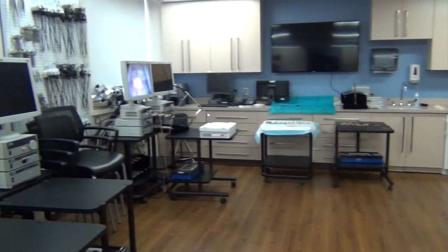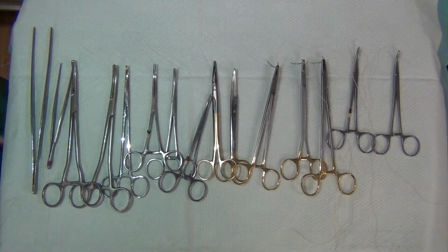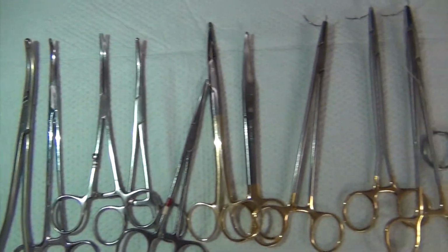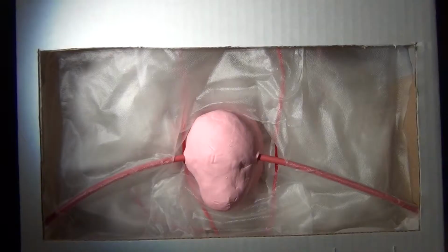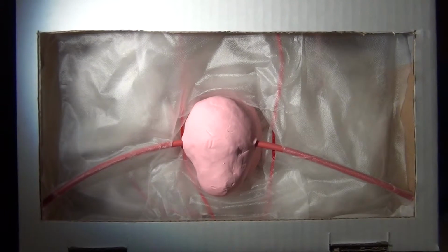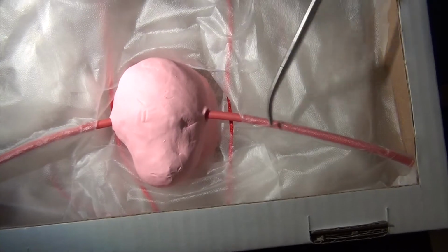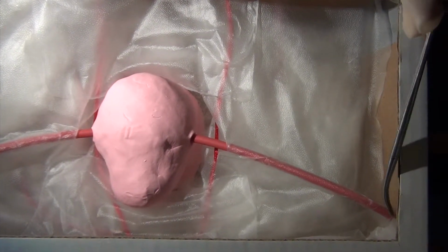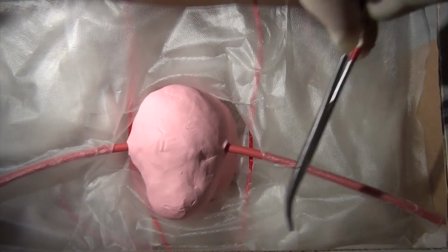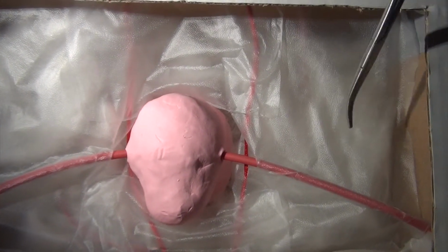So this is our simulation lab at Georgetown University Hospital. And next you'll see the instruments that are being used for the simulation. And note on our model there is no adnexa, but we will pretend for the sake of the simulation that an adnexa exists. So this is our simulation model of our retroperitoneal dissection. In general, just to point out the structures, here's our uterus. Our Foley catheter is used as our round ligament inserted into the inguinal canal. The uterine vessel is here, and the tissue above is our peritoneal reflection. This is our anterior leaf of the broad ligament and our posterior leaf of the broad ligament.